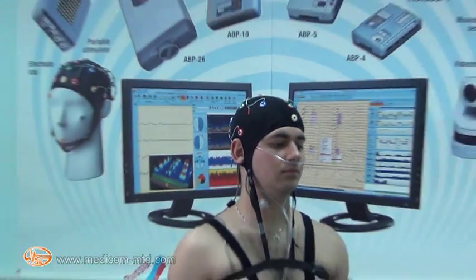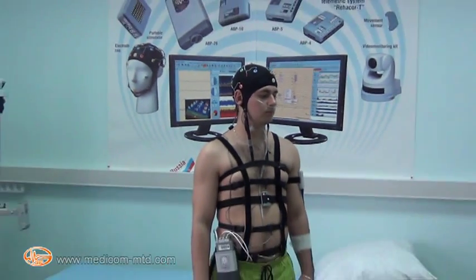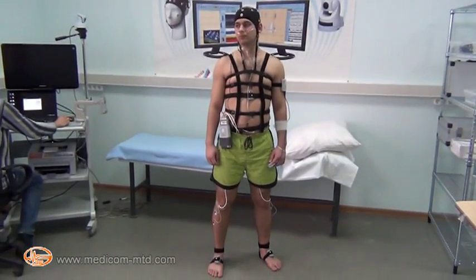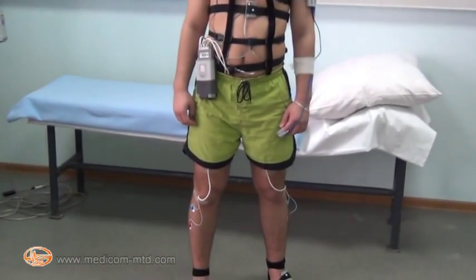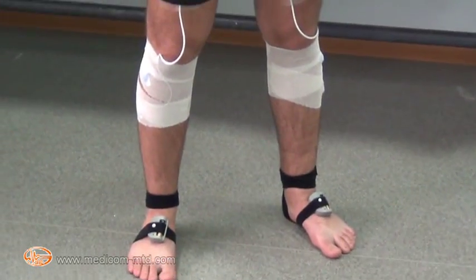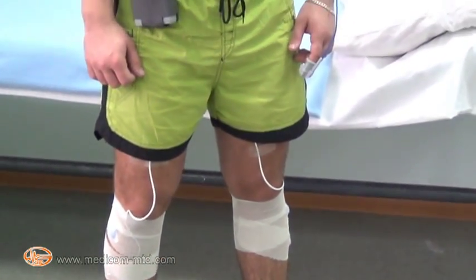On the patient's head there is a fixing cap with electrode system ES11 providing 12 EEG channels. On the legs of the patient, myographic electrodes are visible for movement activity recording along with wireless movement sensors.